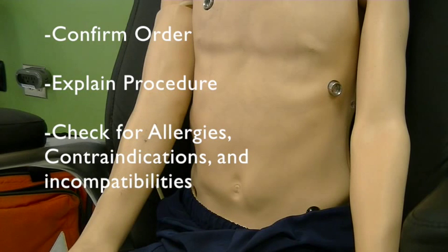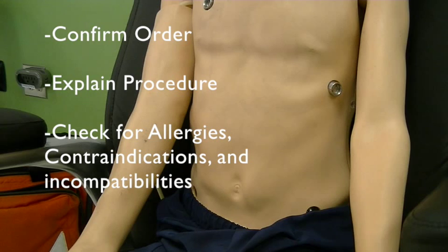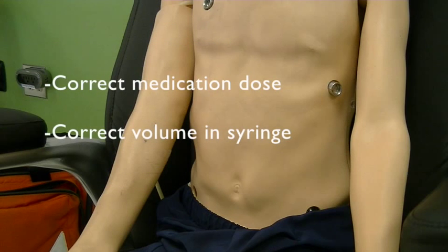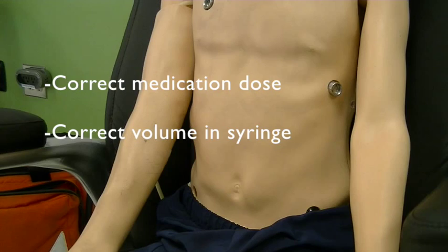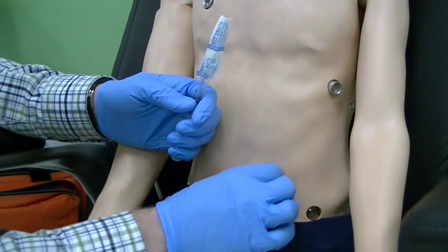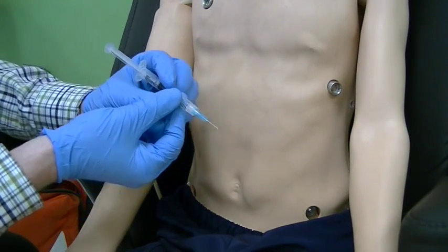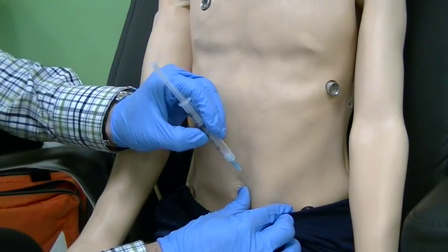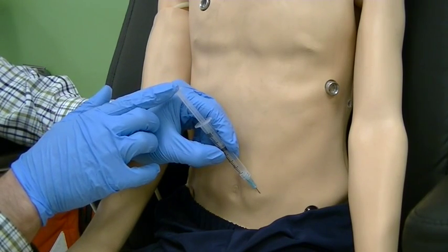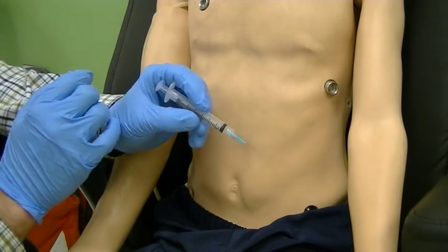Confirm the order for the medication and explain the procedure to the patient. Check for any known allergies, contraindications, and incompatibilities. Check the medication for correct medication, clarity, expiration date, and concentration. Calculate the correct medication dose and measure the correct volume of medication into the syringe. Select the appropriate injection site for subcutaneous injection and cleanse the site appropriately. Pinch the skin around the site and introduce the needle bevel up at a 45-degree angle in a quick motion. Pull back on the plunger to aspirate and check for the presence of blood, then administer the medication. Dispose of the sharp in a sharps container.